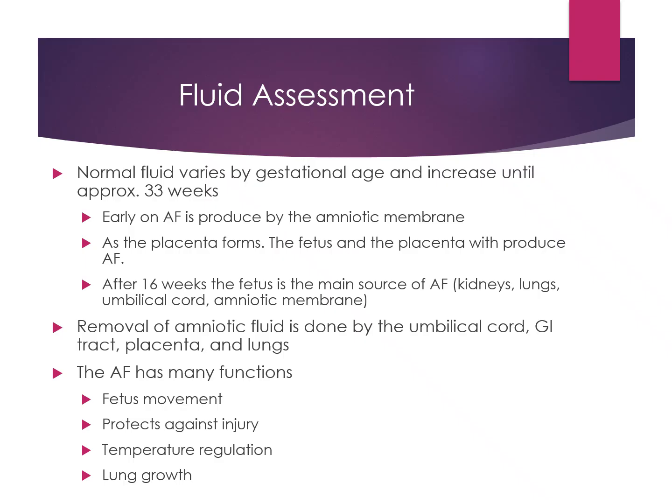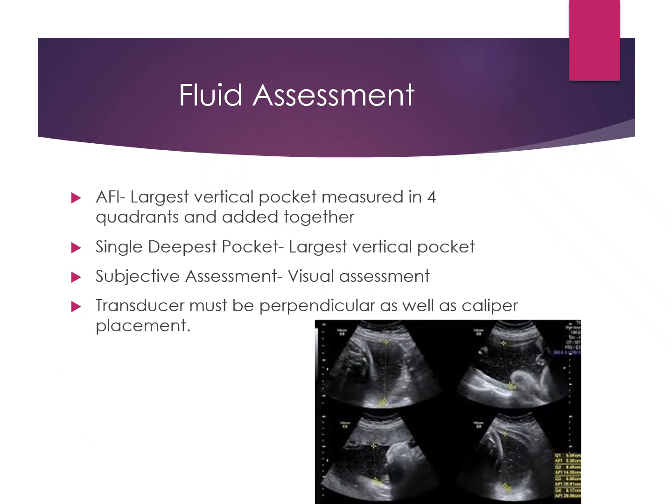And then the amniotic fluid will also help mature those lungs. When we're doing a BPP, we actually look at the fetus breathing, and there's no air in there. So there's nothing for that baby to be breathing in other than amniotic fluid, which will give practice for the lungs to grow and mature and prepare baby for the outside world where there is air. So we really want to make sure that they have the appropriate amount of fluid in order to thrive.